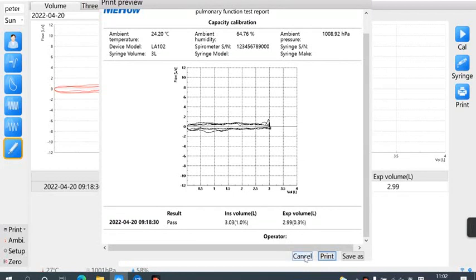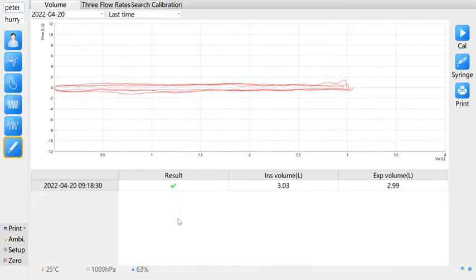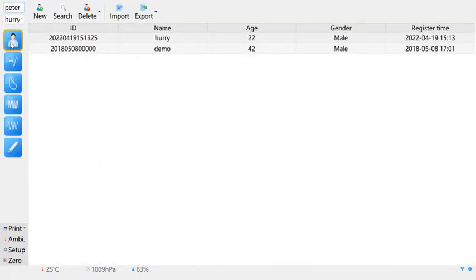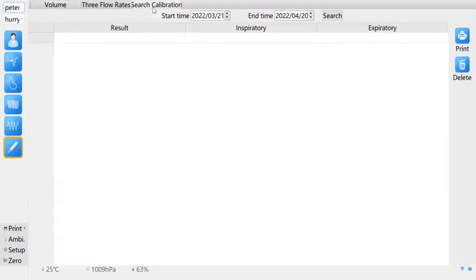Click Print below to print the calibration report. Click Cancel to return to the calibration interface. After successful calibration, click the first icon on the left to return to the main interface and enter the instrument's single inspection status. To query the calibration results, click the sixth icon on the left and click Calibration Query.